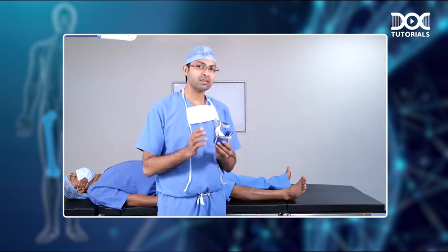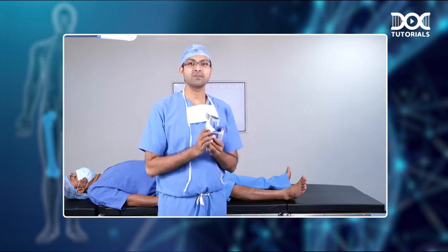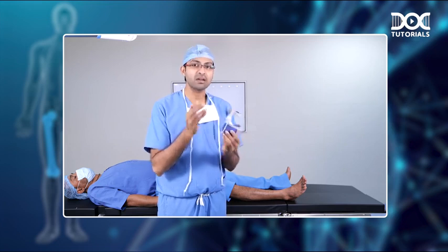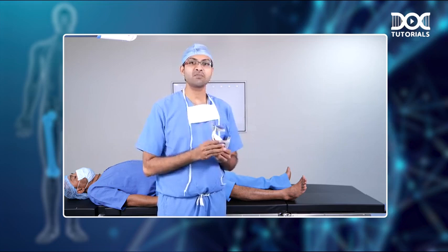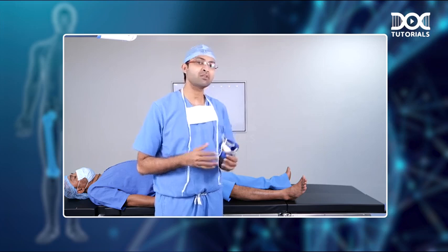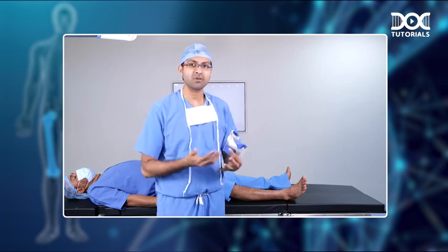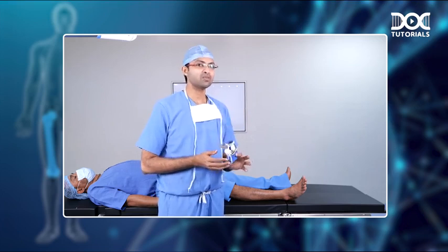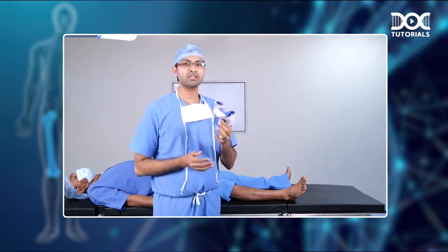So what will happen is that because of the hallux valgus deformity, the head of the first metatarsal will form a small bulge, and this is what we call as a bunion. And sometimes bunion can be very painful and it will cause difficulty for the patient to walk with this deformity. In this condition, we use the bunion splint. So I'll show you how to put this bunion splint.